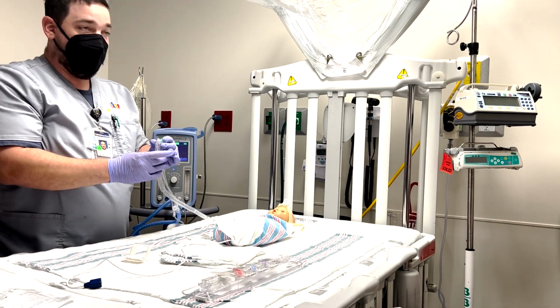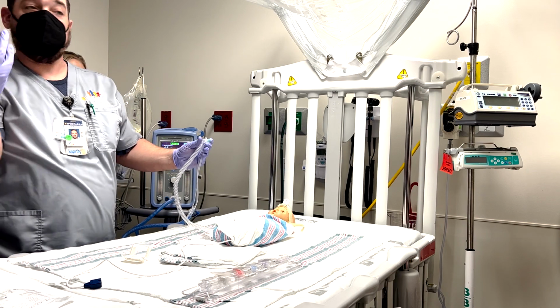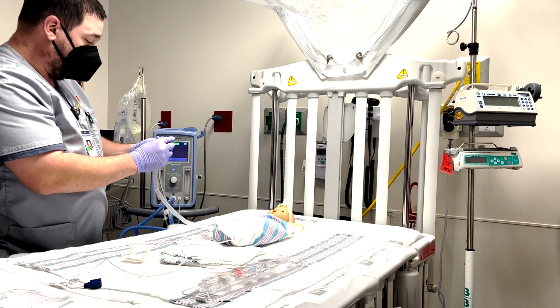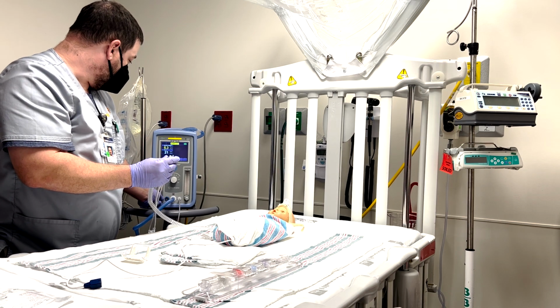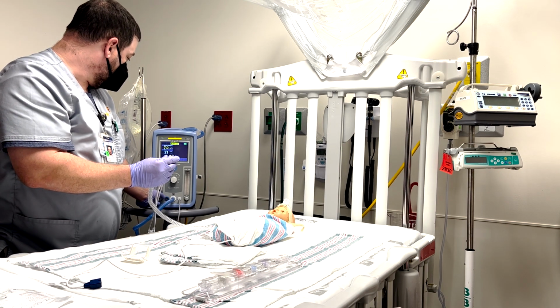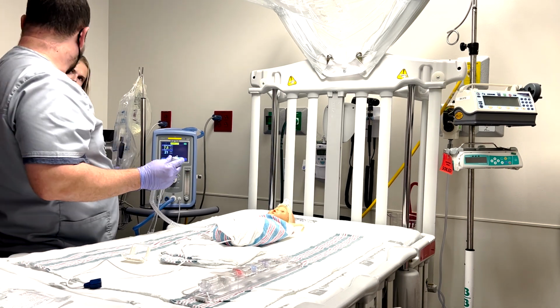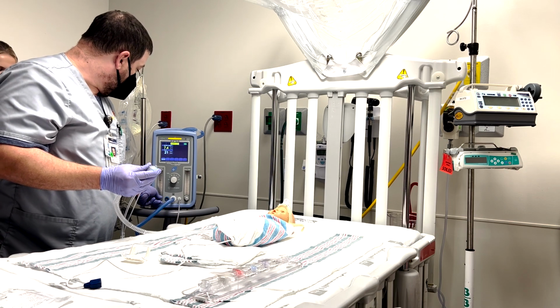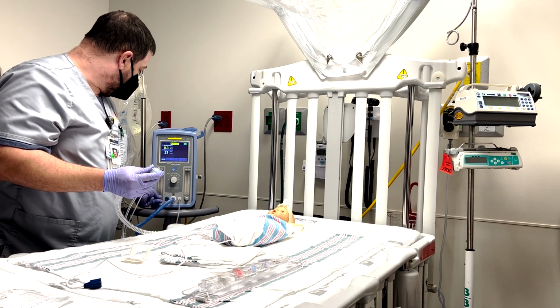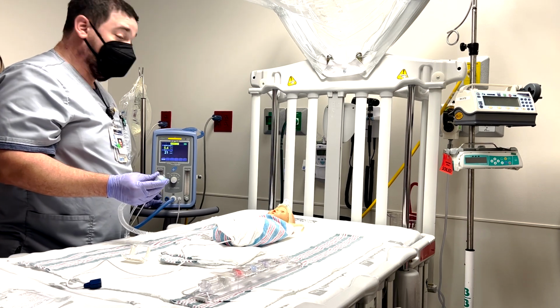Anytime it's occluded, the machine's saying this is what I'm feeling. If I need more, say about 6 or 7, all I have to do is go up on the flow. Increase flow, increase PEEP. It's directly proportional. Nobody should be touching flow without a respiratory therapist. That's not the same as high flow.